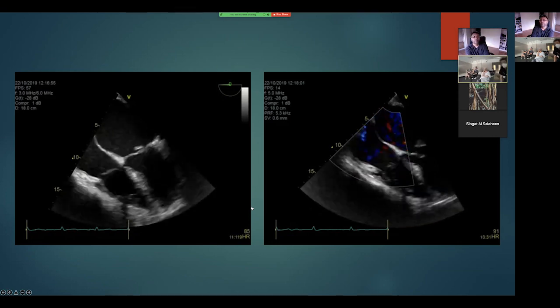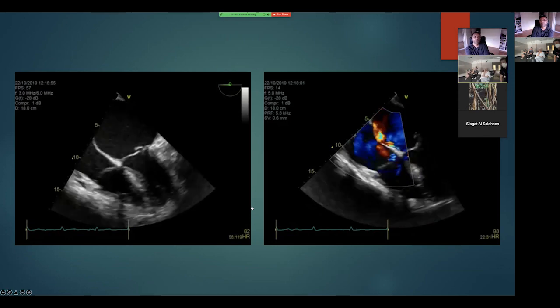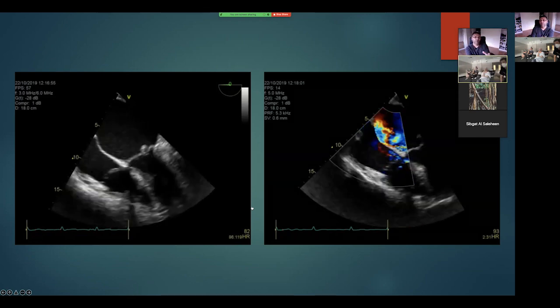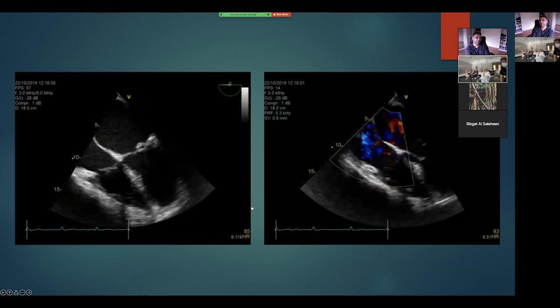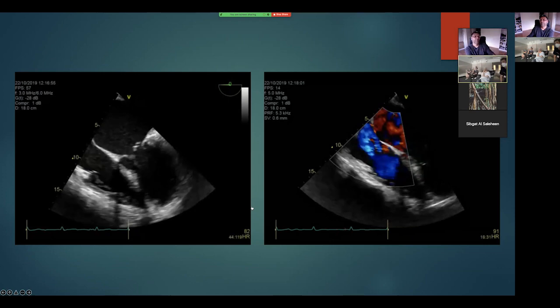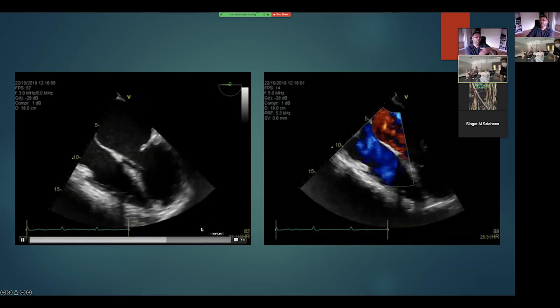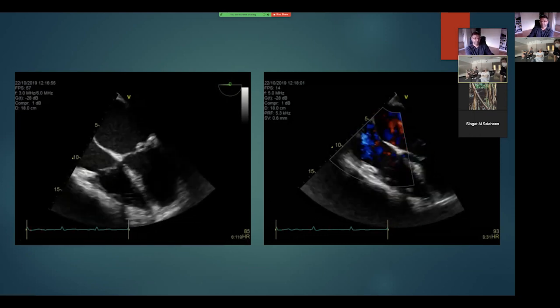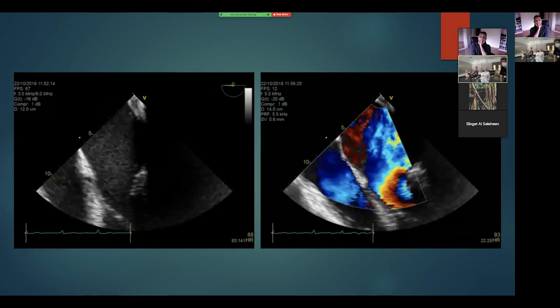Okay. So in the four-chamber view, it will be A1, P2, P3. So at four-chamber, zero degrees, you're cutting in the middle. Oh, sorry, P1, A2, A3. P2, P2. Is it? Sorry. Okay, fair enough. So we're cutting down the center. Okay, all right. Well, as you've said, that's P2 then.